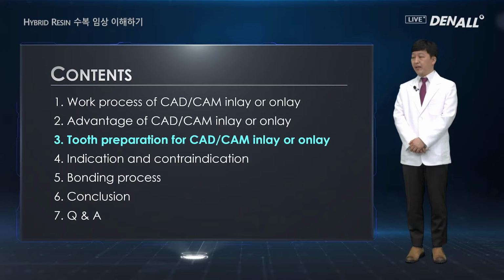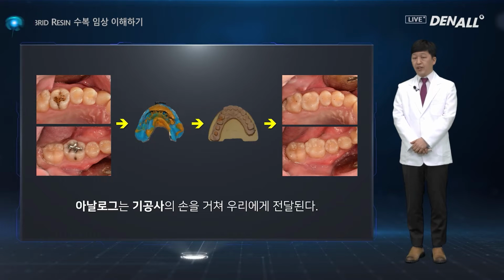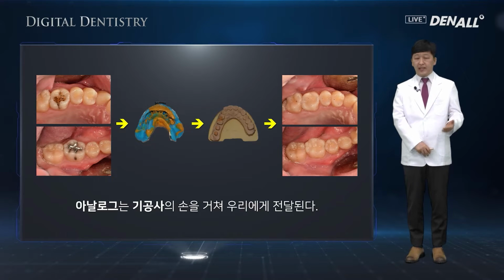Third, I'm going to talk about tooth preparation for CAD/CAM inlay or onlay. When we provide analog inlays, the analog restoration goes through the hands of lab technician.